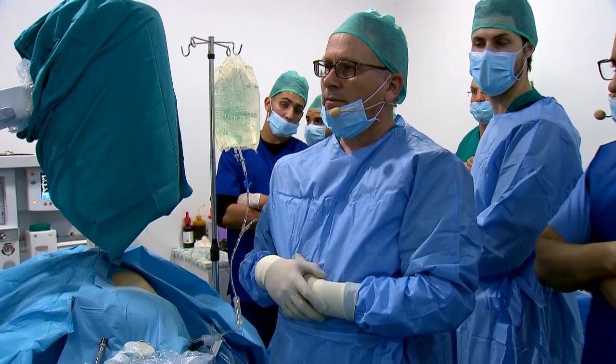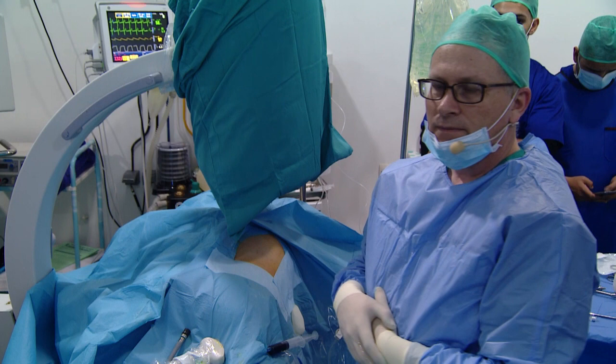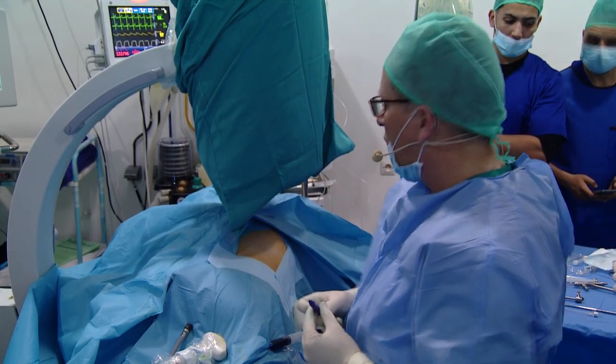We don't use methylene blue marker, only in a specific case, when we had a cyst beside the calyx where we want to do the puncture. Otherwise, when we have clear fluid, we are in the kidney and the methylene blue is not really necessary. I'm talking about the first puncture, but of course, this is sterile. If you lose the tract, it is very helpful to find it once again. No, you're completely right. It is not obligatory to have methylene blue.